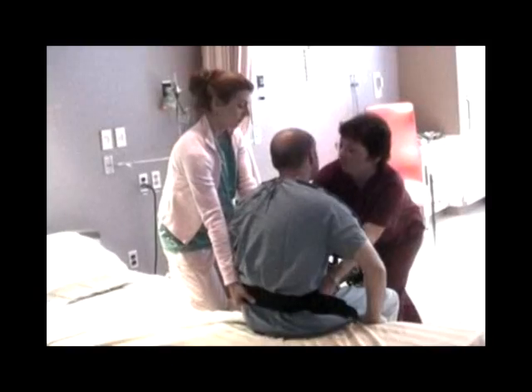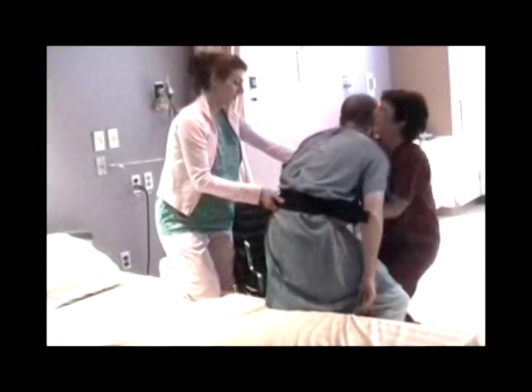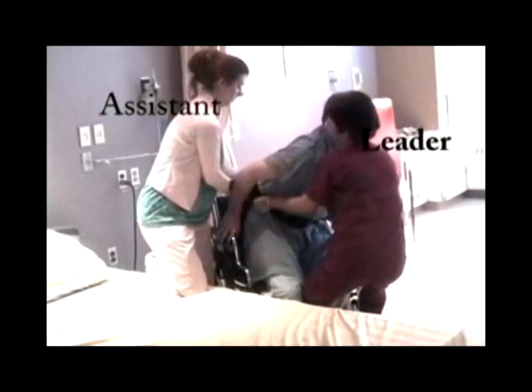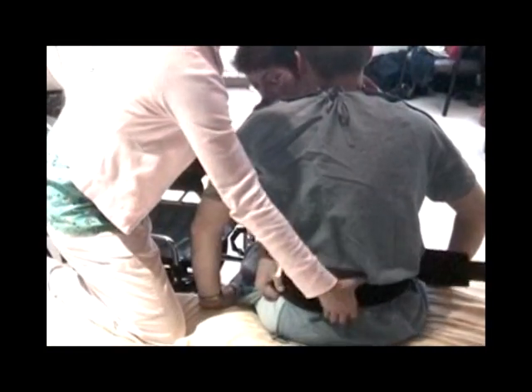Procedure for the 2-person transfer using the transfer belt. In the 2-person transfer, there is a leader and an assistant. The leader conducts the lift in the same manner as for the 1-person transfer. The assistant should stand between the wheelchair and the bed, with one knee on the bed. The assistant should only be assisting with the transfer, guiding the patient and not bearing much of the patient's weight.